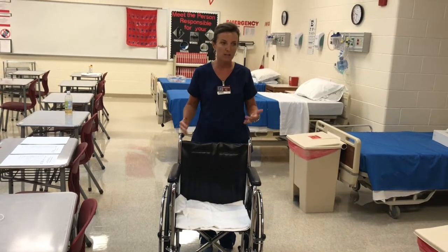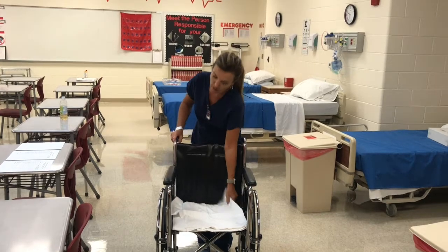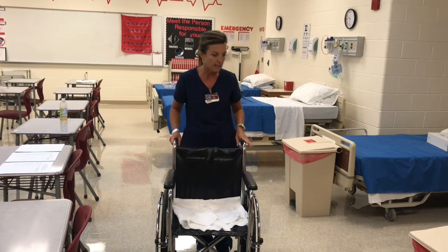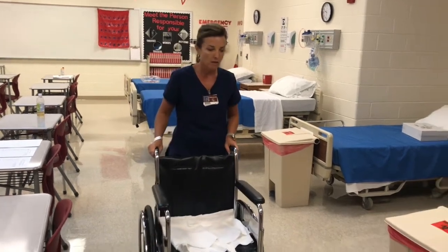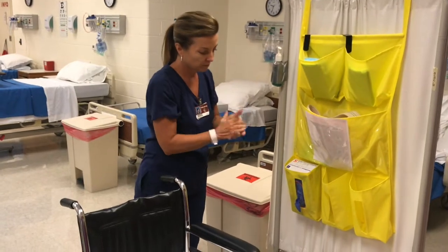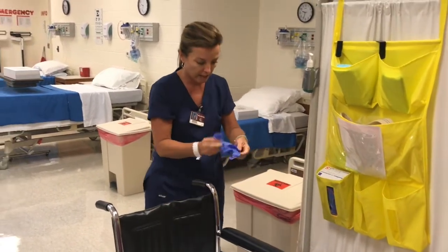First thing we need to do is gather our equipment. We're going to need a wheelchair, some sort of blanket to cover the patient and provide for privacy, and I'm going to need some gloves. First thing I'm going to do is come over, use my hand gel, grab some gloves, and I'm just going to stick these in my pocket in case I need them.